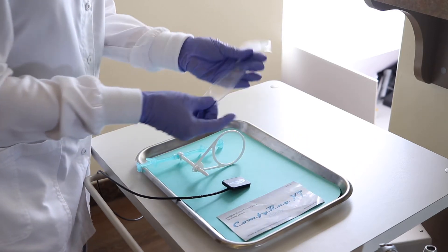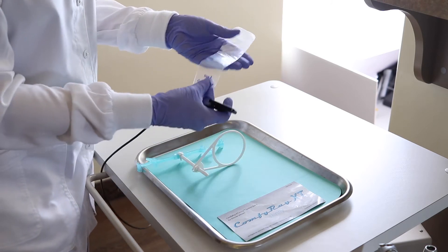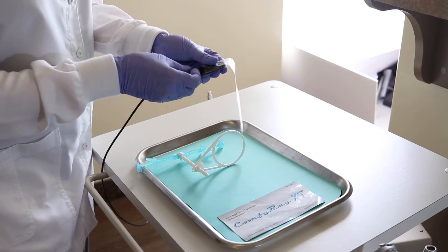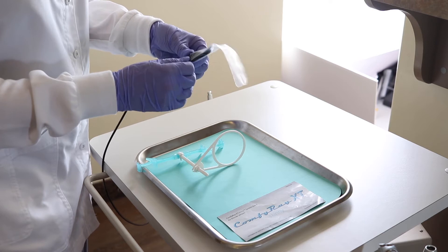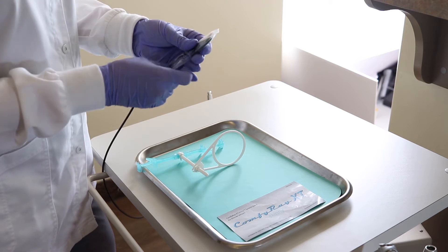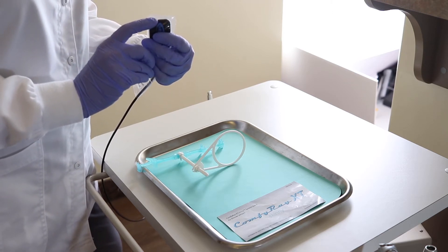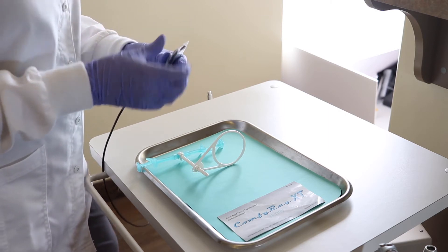I'm going to go ahead and use one of our rounded edge sensor cover sleeves on our Dentimax sensor. These are much more comfortable for patients — it prevents them from having a gag reflex and being poked in the back of the throat. We just slide it up. I recommend leaving about a millimeter of space at the top of your sensor so when you're moving this in the holder, it doesn't pull really tight and tear the bag.